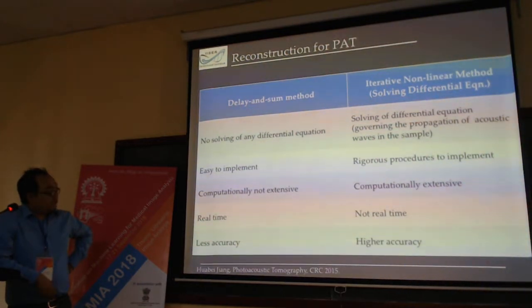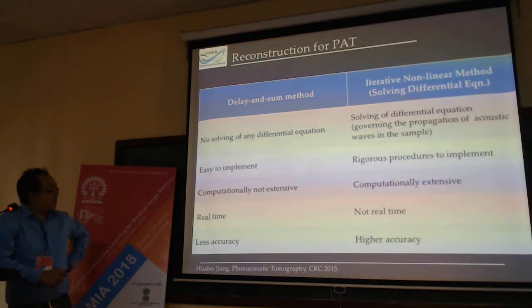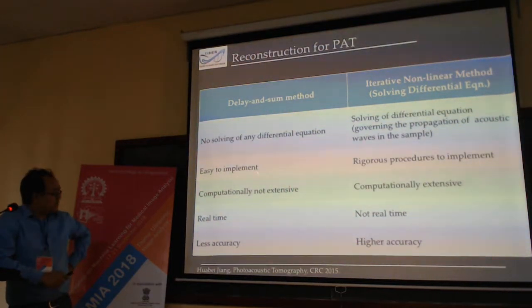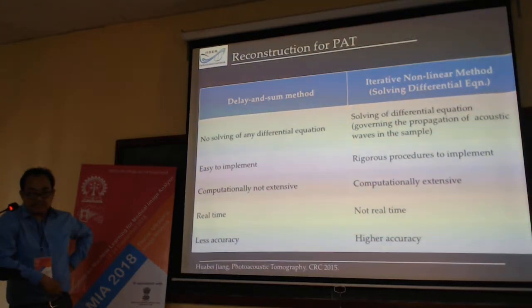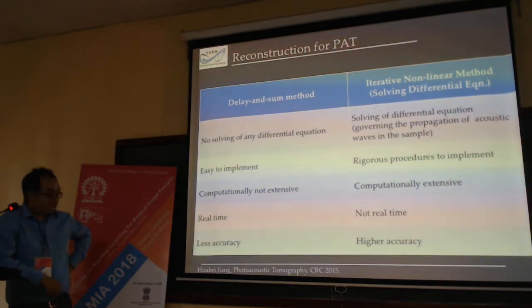The other is the iterative methods that involve solutions of differential equations. Delay and sum does not involve any solution of differential equations. It is very effective and real time, suitable for clinical applications. The iterative method is accurate, at the cost of time and expenditure.